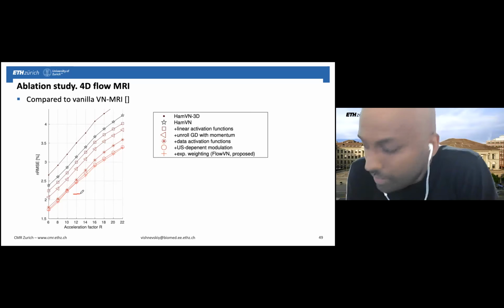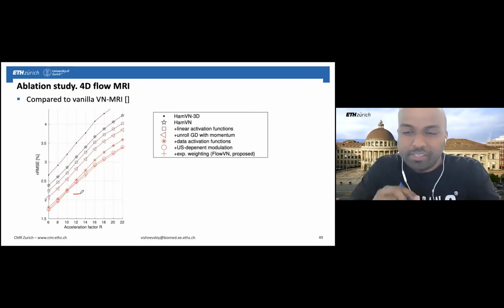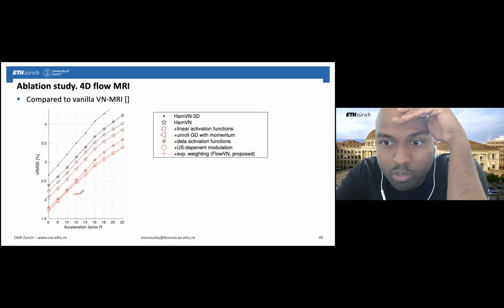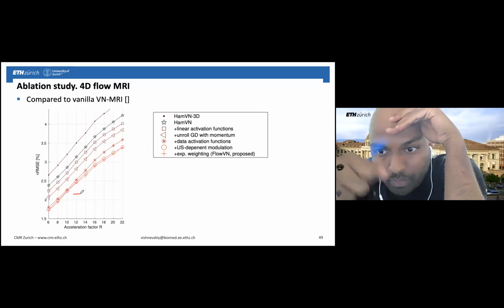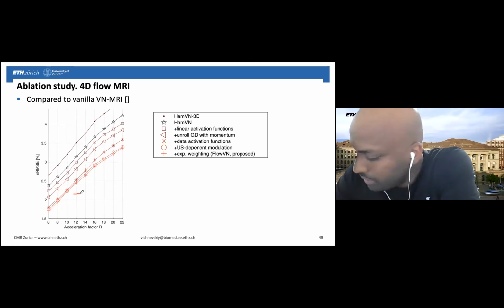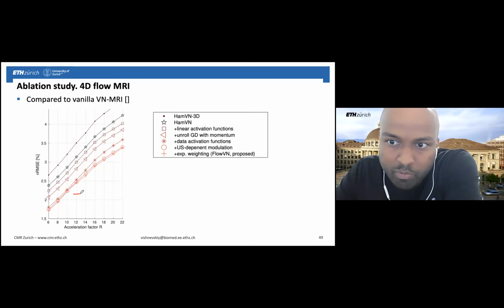I also have a question. So this very nice story that you presented starts from the classical methods, with a very low number of learnable parameters: just the gradient descent step and the weight for the regularization. Then you gradually increased the degrees of freedom of the model, right? Making the derivative operator learnable, and then the activation function learnable. If we just keep going on that path, the other end of the spectrum would be a completely black box model, right?